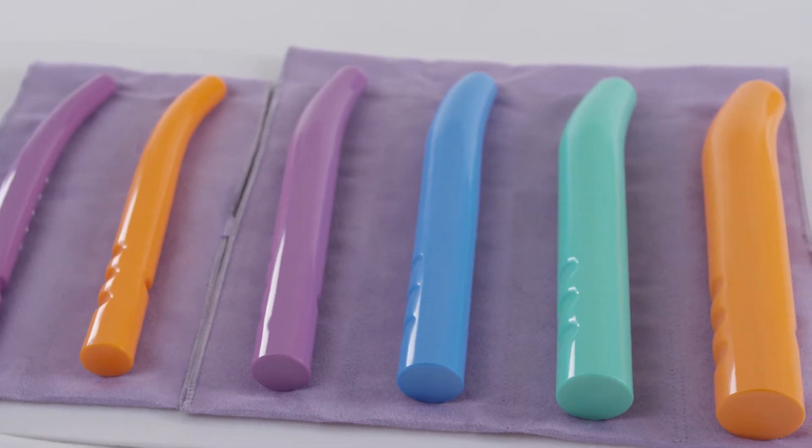When using SolSource dilators, be sure to use a generous amount of lubricant. After using your dilator, wash it with warm soapy water, dry it with a clean towel, and then allow it to air dry. You may also dry it with a hairdryer.